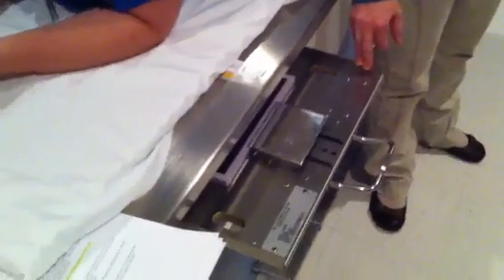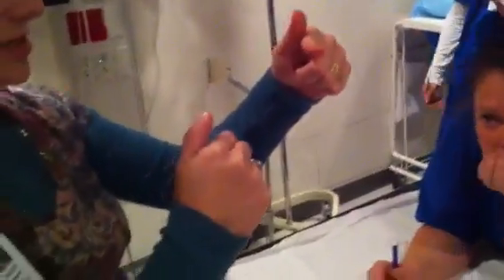It's all good. When you do skulls, one thing you want to remember is that in the tables there is a metal bar up here — it's about this thick and it's on every single table. So if you have the patient's head up here, you're going to have a nice metal bar right at the top of the skull and you're going to have to repeat it. So when you have your patients on for skulls, you want to move them down.